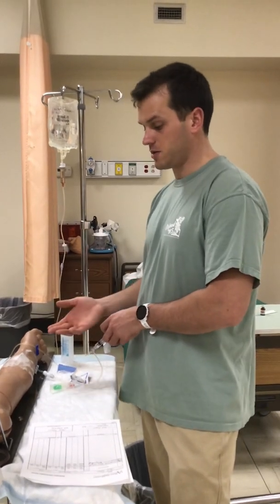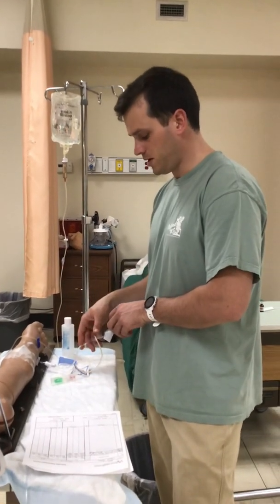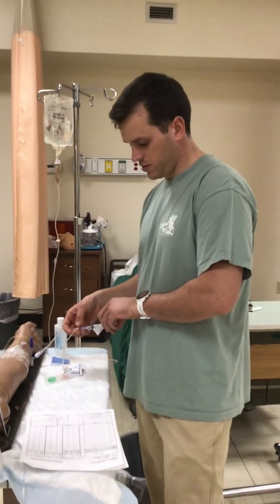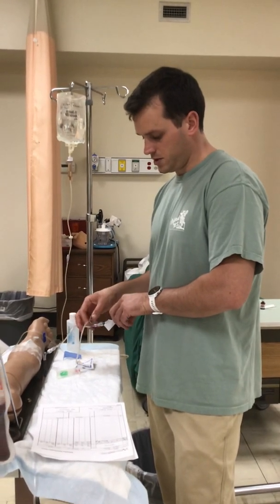I can go ahead and ask my patient if she's feeling any discomfort, anything at the IV site, any pain. Pinch, administer, release.